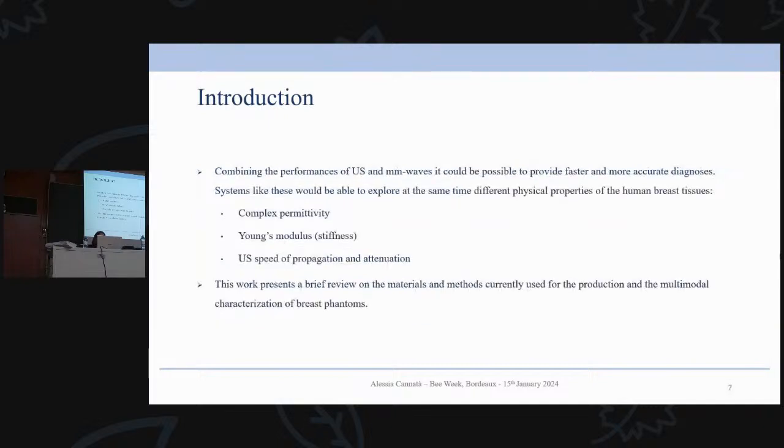And hopefully, in the future, we can exploit the potential of multimodal medical imaging. So, for example, in an ideal world, we can use a technique which can provide different physical information about the same tissue at the same time. In the future, we can have a scanner which can investigate the dielectric properties of tissue, so the complex permittivity, but even the Young's modulus, so the stiffness, and the US properties. This may increase the accuracy of our diagnosis, and it can provide faster diagnosis as well. And during the presentation, I will try to explain to you how I worked with the multimodal phantoms in order to develop such techniques.